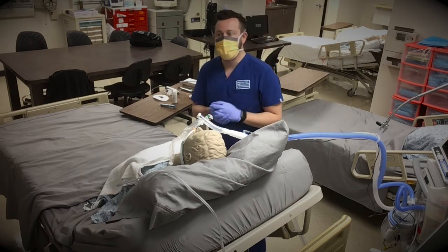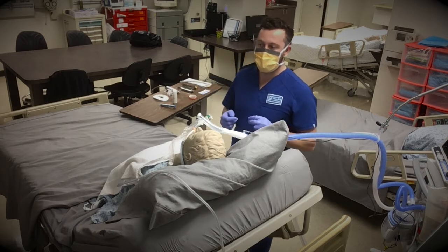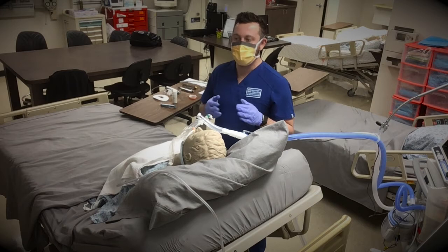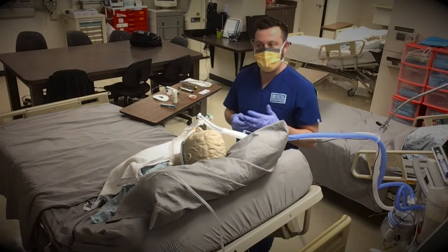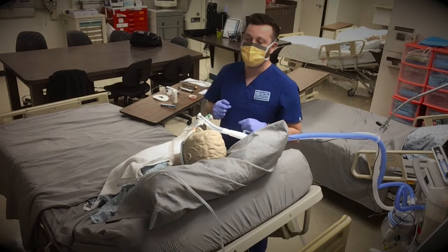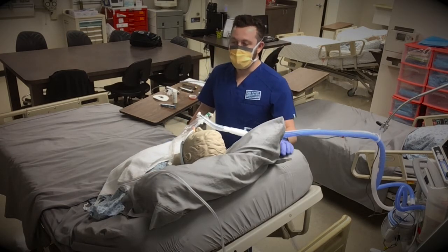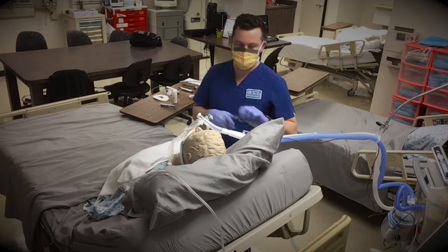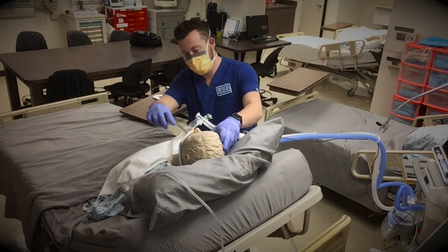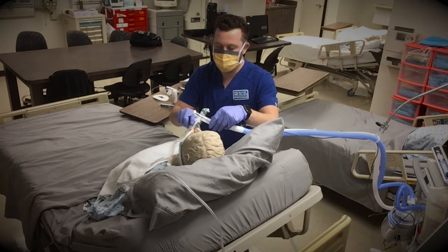So the next step, we need to suction the endotracheal tube and pharynx to above the cuff. Suction before extubation helps prevent aspiration of secretions after the cuff is deflated. Now, we should be prepared to suction the oropharynx. I'm just using this for demonstration, it's not hooked up for suction. So it's suction out the mouth on both sides.